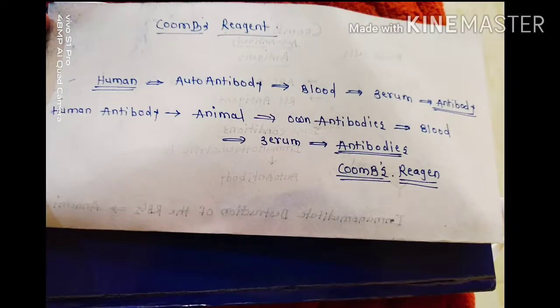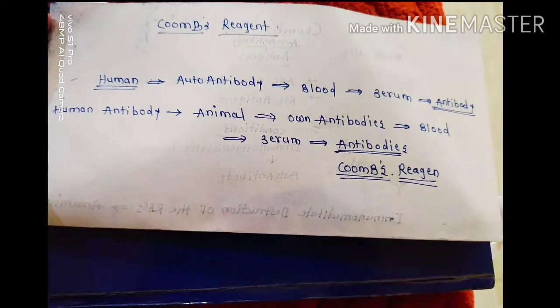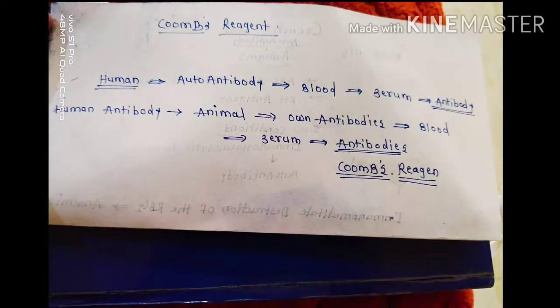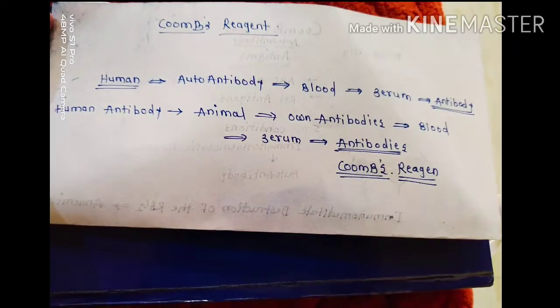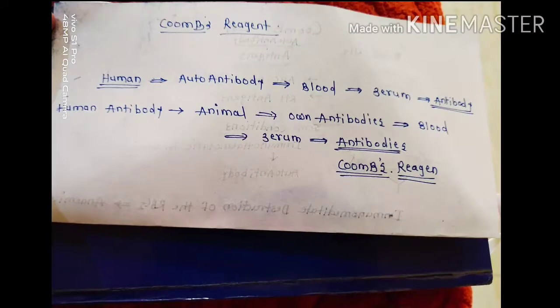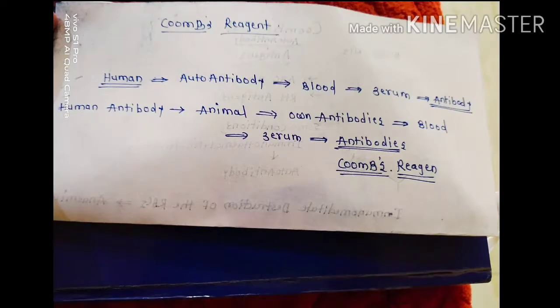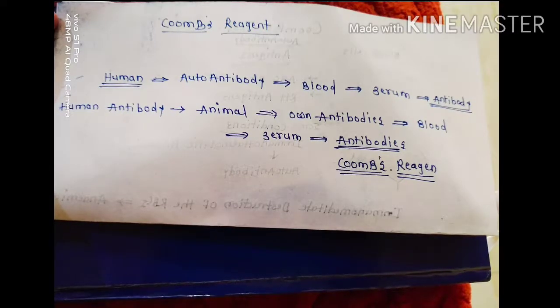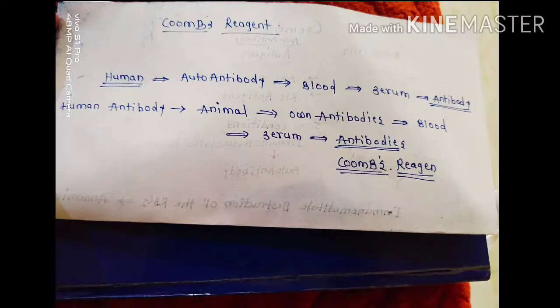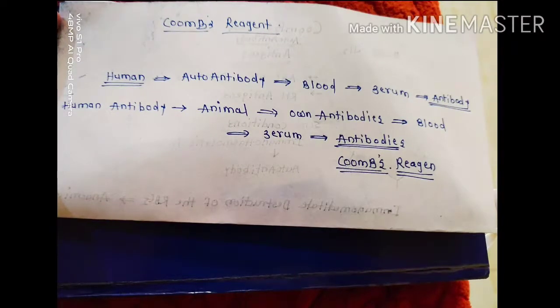Then this animal produces its own antibodies against these autoantibodies of the human. When the animal produces its own antibodies, we take a blood sample of the animal and separate the serum from this blood. This serum contains antibodies, which we call Coombs reagent.